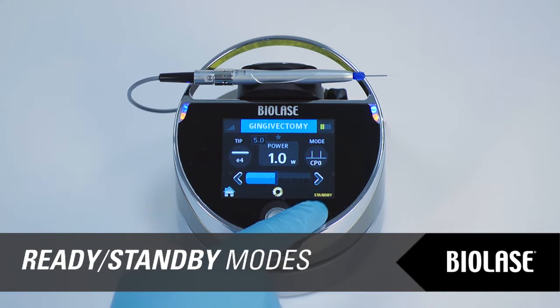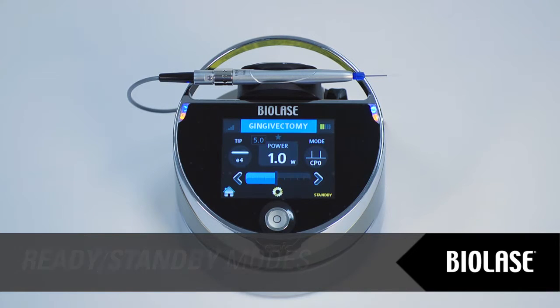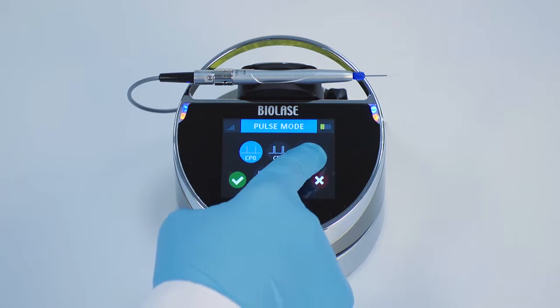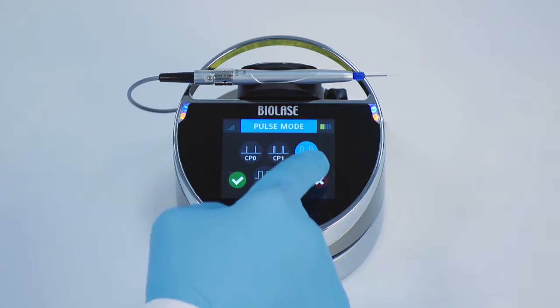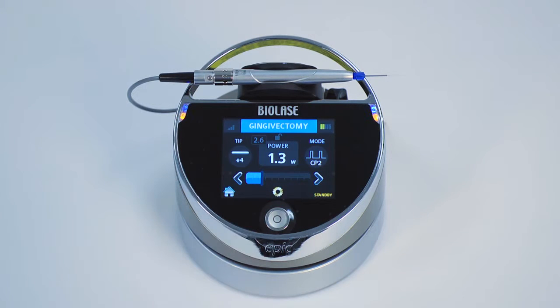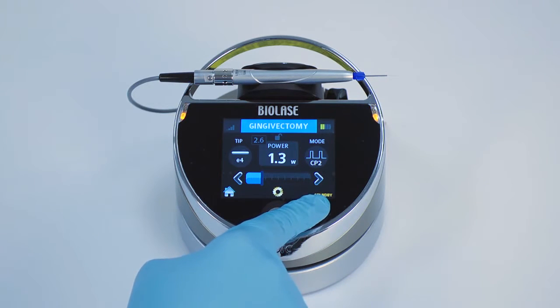The laser console will only emit laser energy when the foot switch is pressed and the laser console is set to ready mode. While in ready or standby mode, you may change modes, power settings, and other variables only when the foot switch is not engaged and the laser is not firing. Adjusting any settings is blocked when the laser is firing. Also, note that ready or standby is displayed in the lower right-hand corner of the display screen.